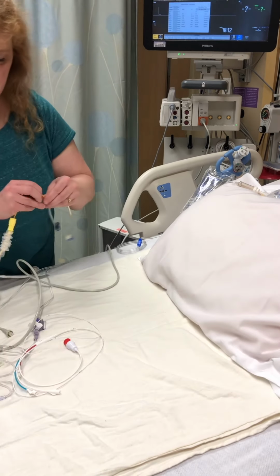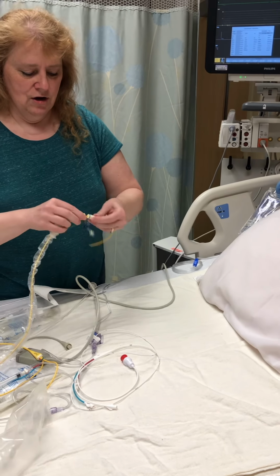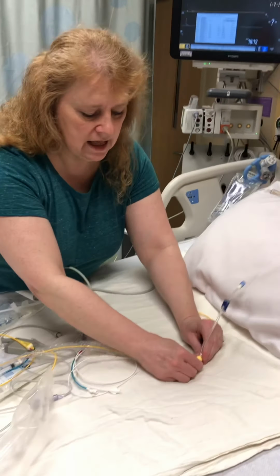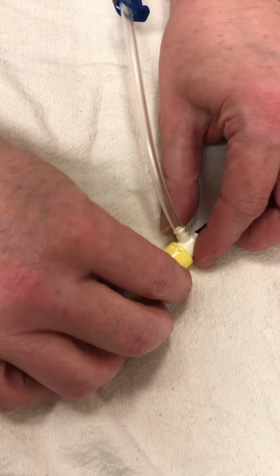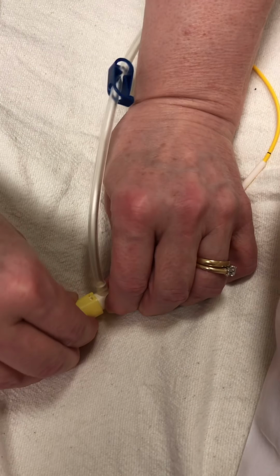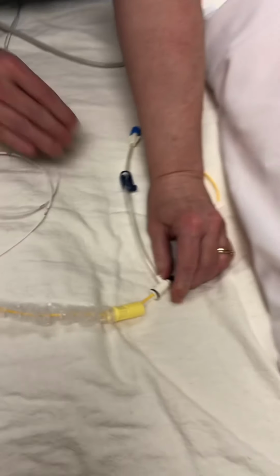Actually, you know what? Sorry, it'll have to be redone here. Okay, when the swan is in, it is locked like here. You have a little notch here. When you take the swan out, you're going to unnotch it. You're going to pull this off here like this.